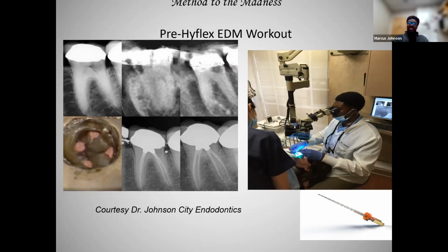Of course, I would not be an endodontist if you didn't see me practicing under the scope. Should probably have that mask up, but that is me in action. It's just a nice case, calcification. I told the patient she's going to need to get a new crown. I was concerned about this area, which is actually on the buccal aspect of the tooth. She's like, just do what you've got to do.